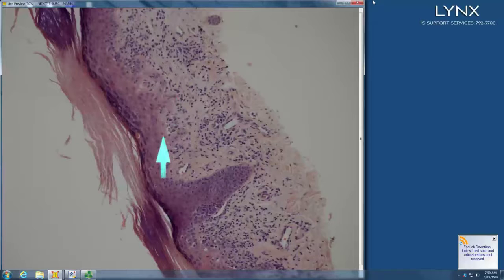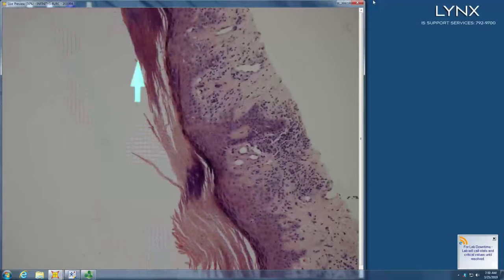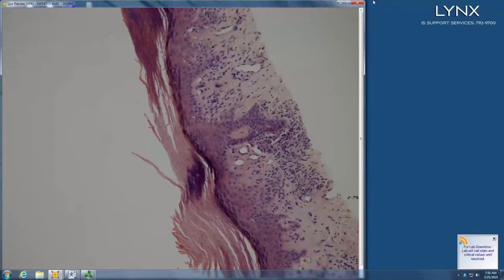Is your basal layer intact? Do you have dead reds? Yeah, so you sort of have areas of lichenoid interface. So again, there's a little bit of atypia there. So it could just be lichenoid AK or something else. Lichenoid, let's see what the history is. Cannot read that again. What does it say? Something papule. L something papule. It's a lichenoid something. Maybe it says lichenoid papule. I don't know. Okay.